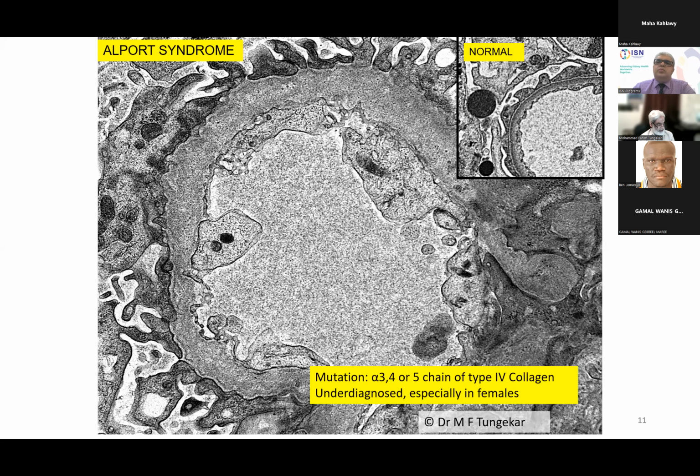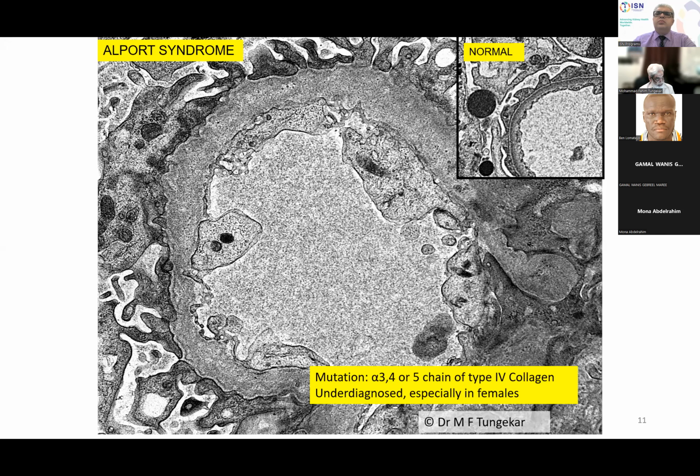PLA2R immunofluorescence is very easy to do. You have to remember that sometimes the serum levels of PLA2R may disappear, but the kidney tissue biopsy does show staining for it. So apparently it remains bound to the glomerular capillary wall, whereas there's very little left circulating in the serum. What else did you ask?